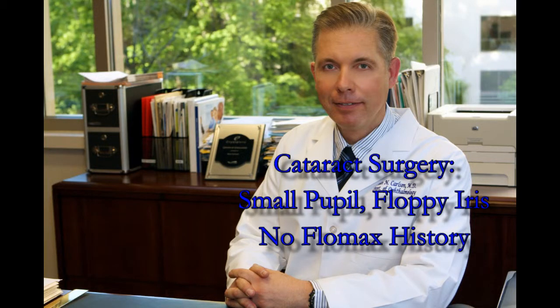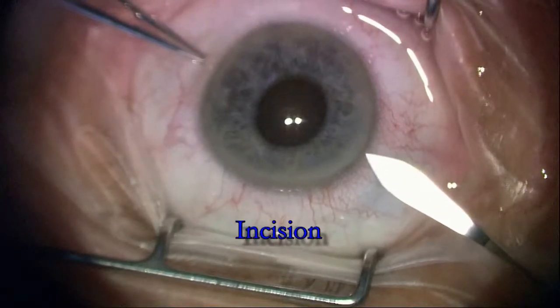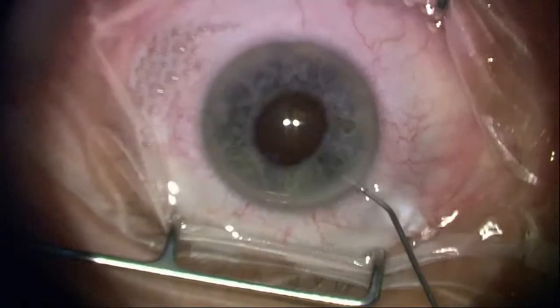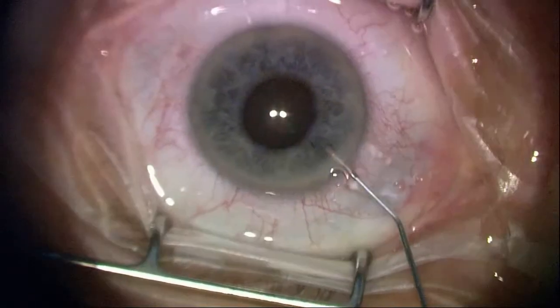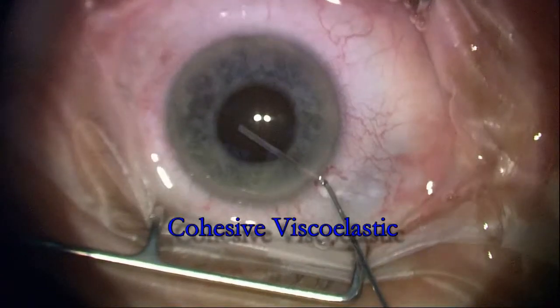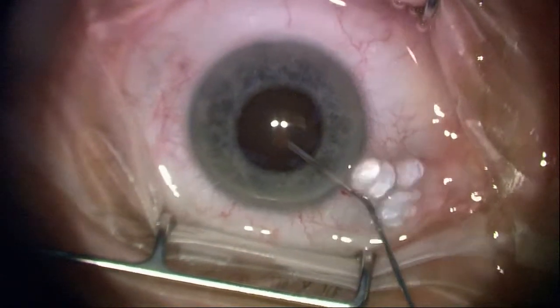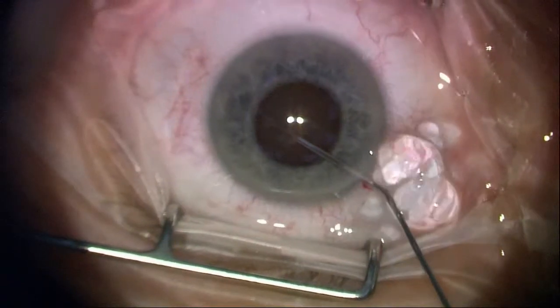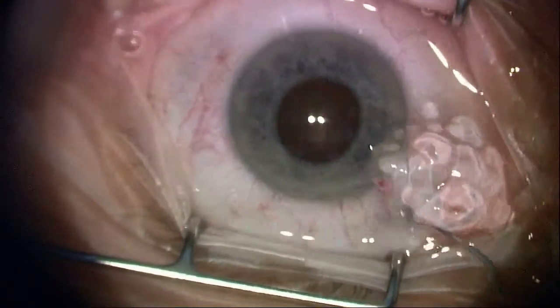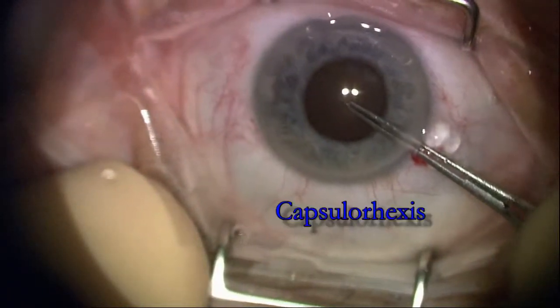This next case is a fascinating middle-aged lady with a fairly dense cataract and small pupil — we saw in the clinic that the pupil dilated poorly. She had all the markings of somebody who'd been on Flomax, but she has no history of Flomax usage or any of the bladder medications that women sometimes have to go on. So we knew in advance this would be an interesting case with regard to poor dilation.